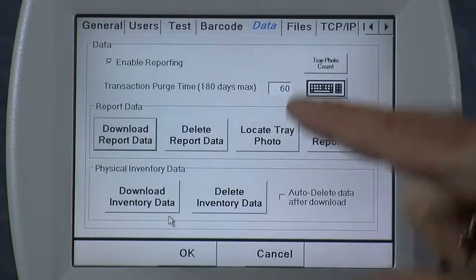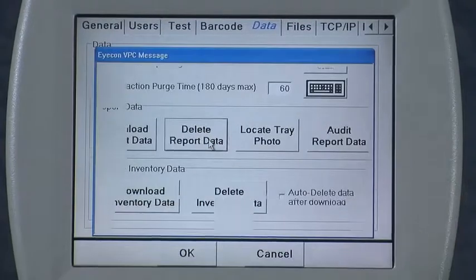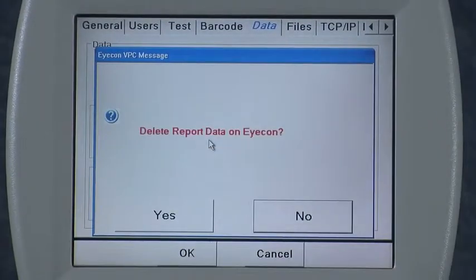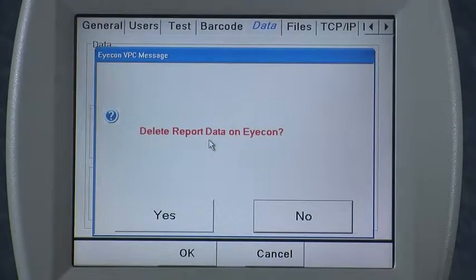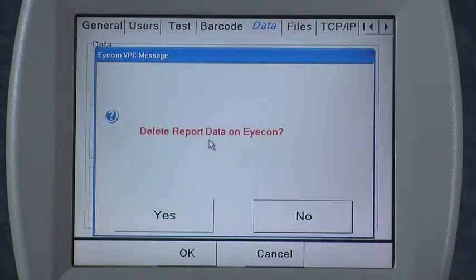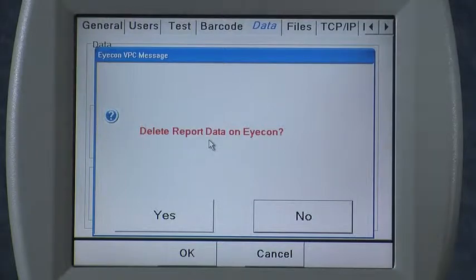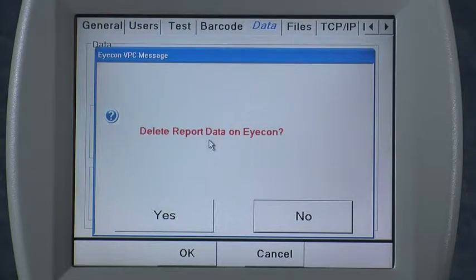The next selection is delete report data. After you've downloaded, if you want to delete you can. It's not necessary to delete all the data — the purge feature is what I recommend using. That will just delete the data when it has achieved a certain age, so that data is still accessible on board the icon up until the purge time.